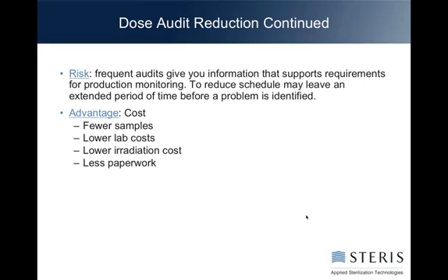But the advantages are clear. You'll be using up fewer samples, you'll have lower lab costs, and lower radiation costs because you won't have to do that verification dose every 3 months. You might be able to do it every 6. And overall, you'll create a lot less paperwork.